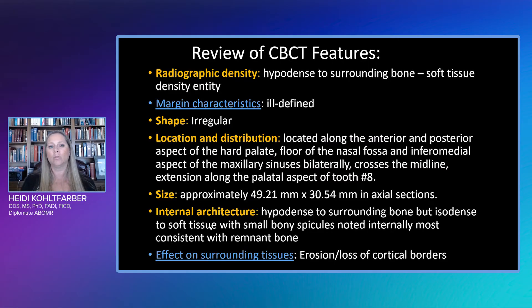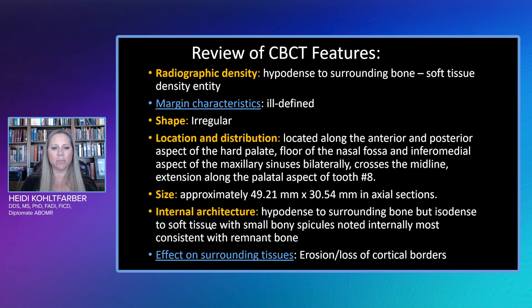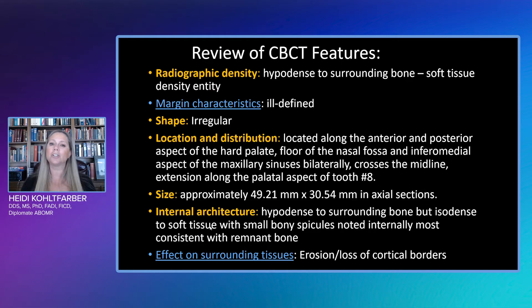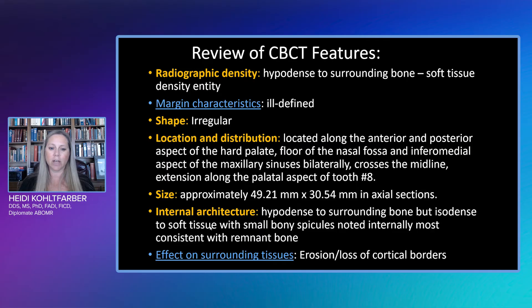So what are our radiographic features? This is hypodense to surrounding bone — really more of a soft tissue density entity. Marginal characteristics are largely ill-defined; we can't tell exactly where it ends. The location spans the anterior and posterior hard palate, floor of the nasal fossa, and the infero-medial aspect of the maxillary sinuses bilaterally. It crosses the midline and extends along the palatal aspect of tooth number eight, though we didn't see root resorption. Approximate size in axial sections was about 49mm by 30.5mm, but there's a large soft tissue component we can't fully see. Internal architecture is hypodense to surrounding bone but isodense to soft tissue, with internal bony spicules most likely representing remnant bone. We do have erosion and loss of cortical borders.